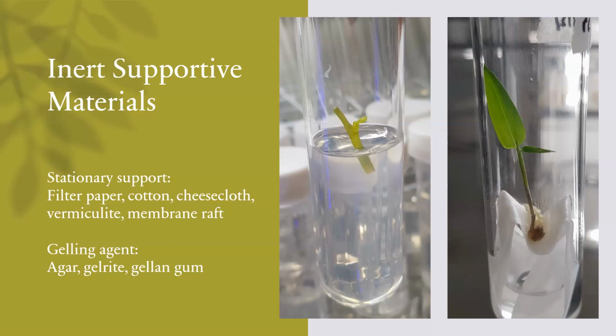Agar is a mixture of polysaccharides derived from extracts of several species of red algae or seaweed, and can easily bind with water to enable explant to be slightly embedded on culture media and allow nutrients to diffuse through the medium to the plantlets. Gel-rite and gellan gum are transparent in appearance and are polysaccharide complexes produced as a fermentation product from a Pseudomonas species.